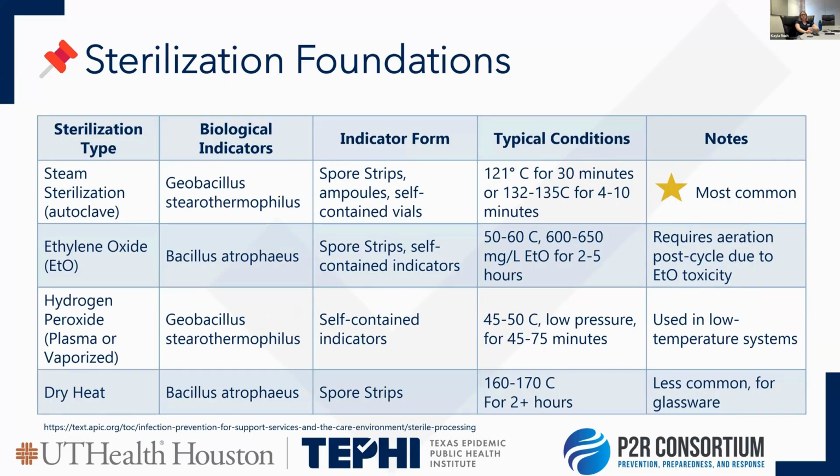Under sterilization, there are many different chemicals that we can use in processes. The most common one is steam sterilization, compared to ethylene oxide, dry heat and hydrogen peroxide. There are different risks to the environment and also to the staff involved in this area. Steam sterilization has been deemed safer because fewer volatile compounds come off of it when staff are unloading and loading the sterilizer, so they're not exposed to them, for any type of upper respiratory issues.